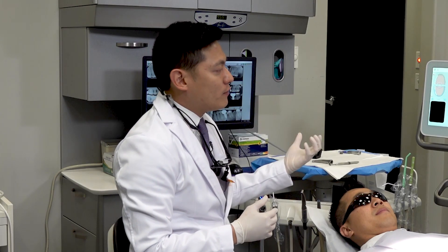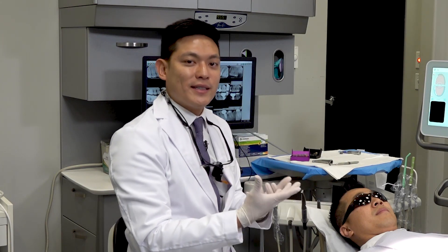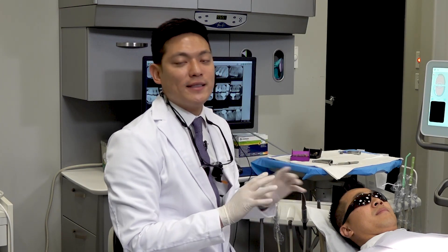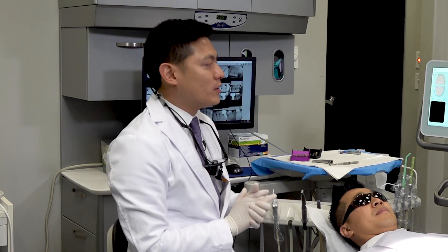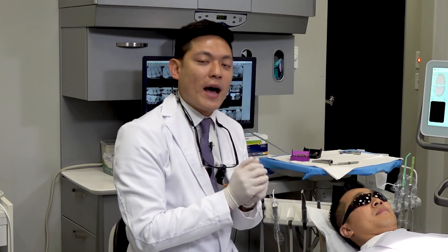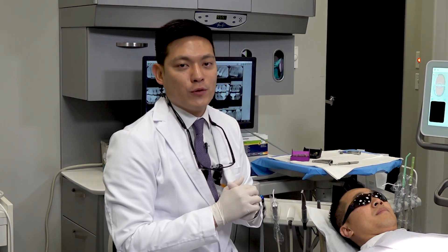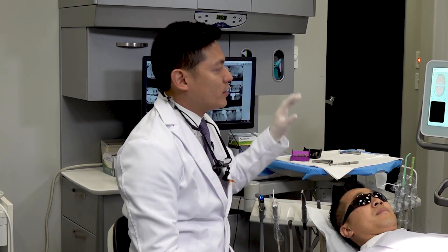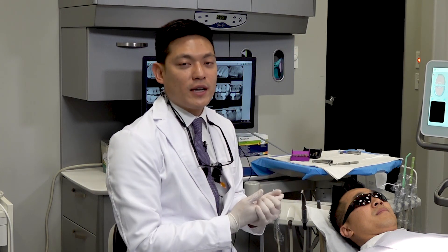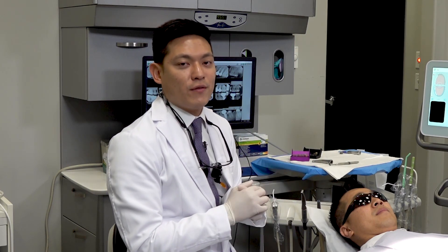We have all of that information and we could send this off, but the system doesn't tell you it's missing critical data — it doesn't know. So it's important that you analyze your digital model to see if you have the information required for the restorative situation. In this case, the only thing that's missing is the contact surface on the mesial side of tooth 31.